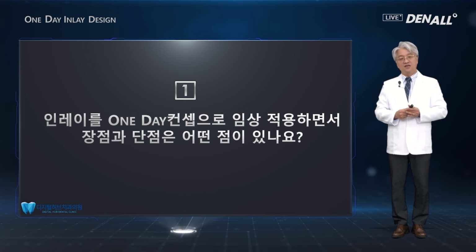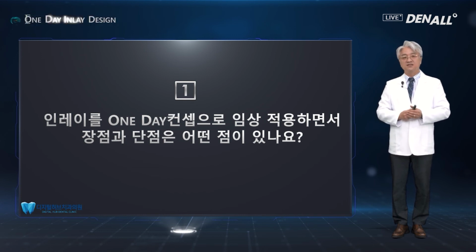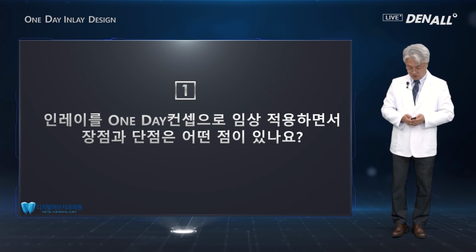But I believe that if you seek support of the digital dental lab, then you need only oral scanner at your clinic to do the one-day inlay approach. So there are much more advantages than disadvantages in one-day concept.